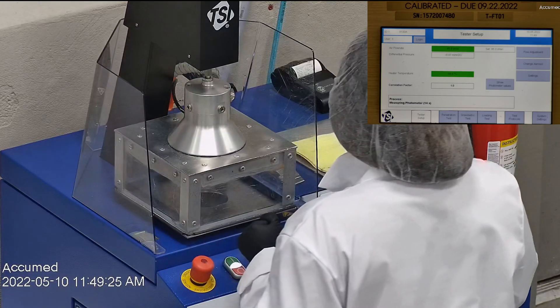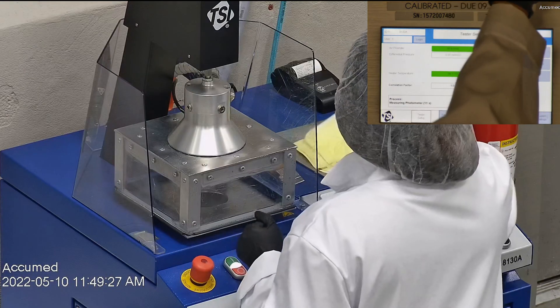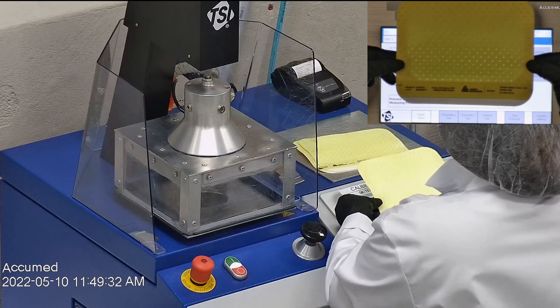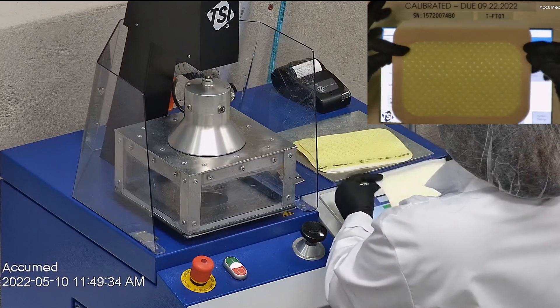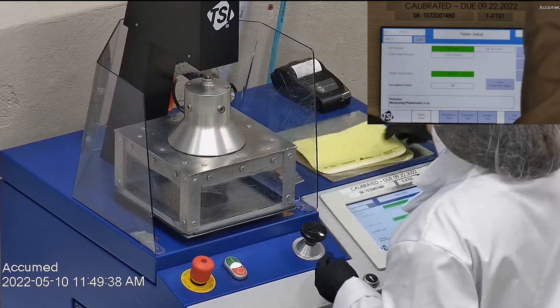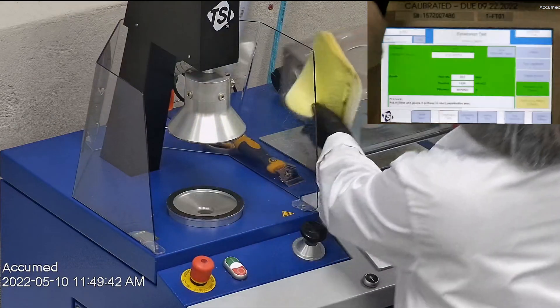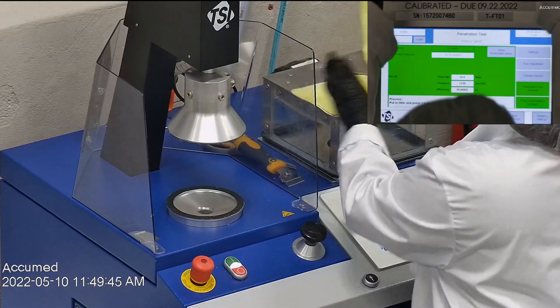With that being said, let's go ahead and see how they do with our TSI machine. We're going to be testing both the filtration and the pressure drop. This is our TSI machine, model 8130A, which is the same filtration testing machine that NIOSH uses to approve N95 respirators. Our procedure is also inspired by NIOSH.